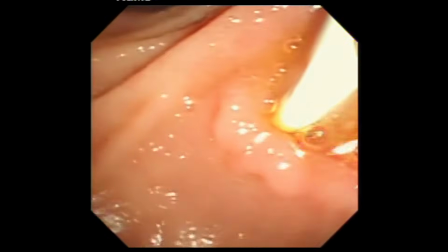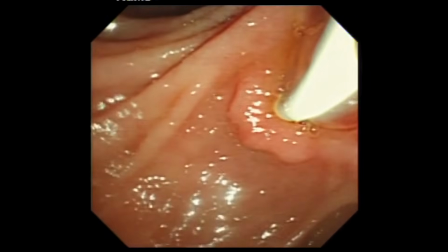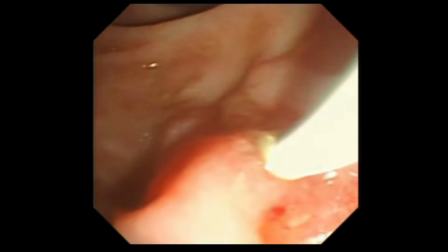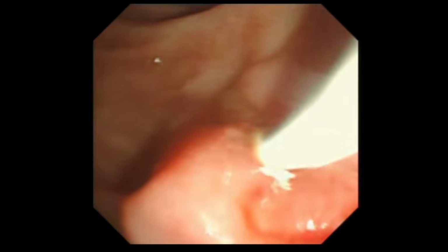Now we are going to distend the biliary balloon and bring it out from the papilla. This maneuver usually helps drag the stent distally and bring the lower end of the stent into the duodenum.